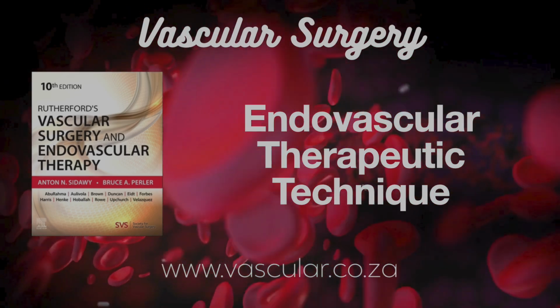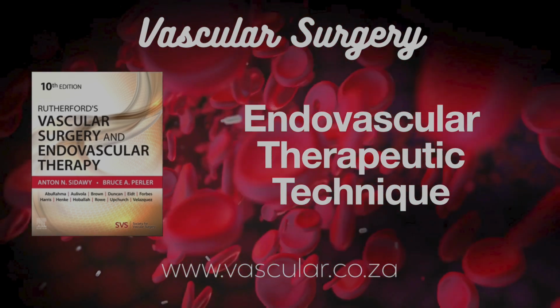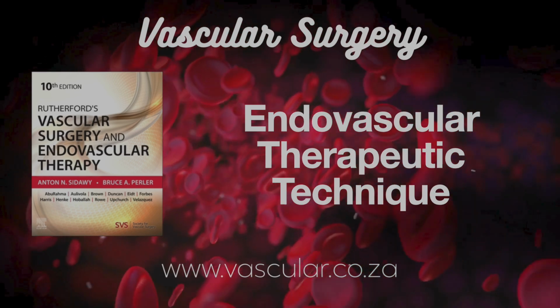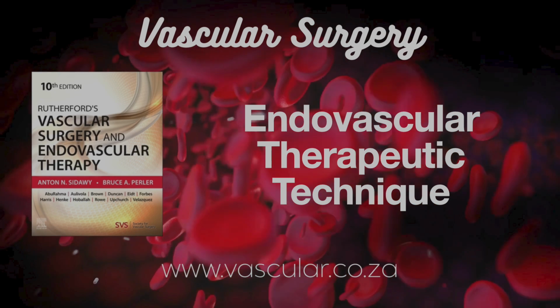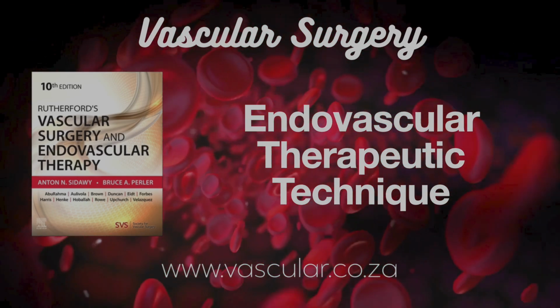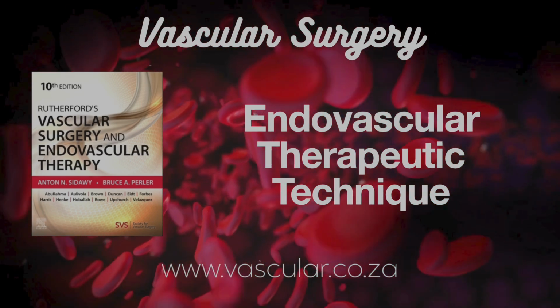So early peripheral DES didn't work as well? Some early ones, like the sirolimus-eluting SMART stent, studied in SIROCCO III, didn't show a significant reduction in restenosis at 2 years compared to bare metal stents in the SFA. Same for the everolimus-eluting Dynalink stent. It seems the biological response might be different in peripheral versus coronary arteries. Why the difference? More complex disease, mechanical forces? Likely a combination. Peripheral arteries, especially in the legs, often have tougher, more calcified, longer blockages. And the mechanical stresses, compression, bending, twisting, are way higher than in the heart. That can affect drug uptake, stent integrity, the whole healing process.